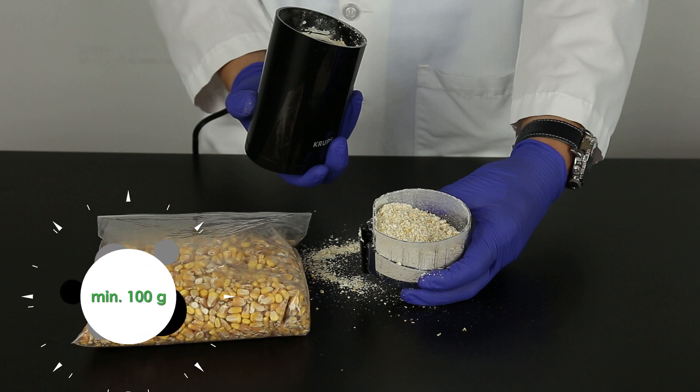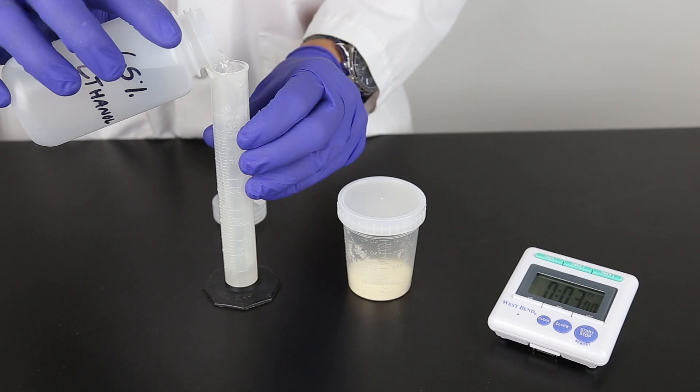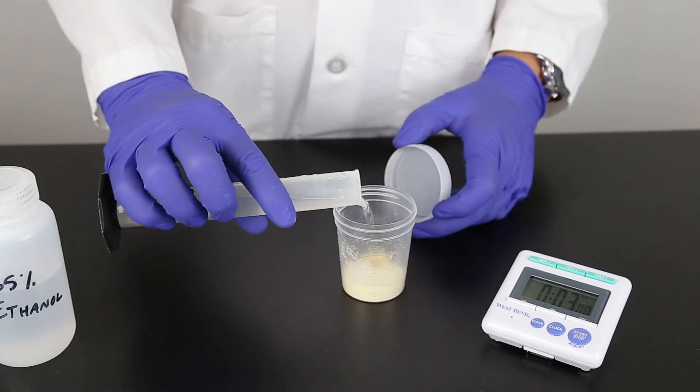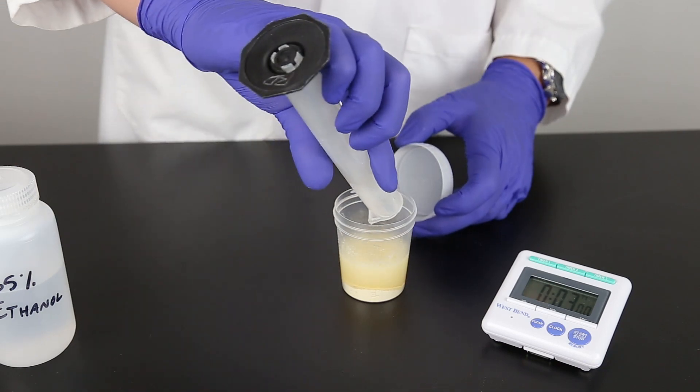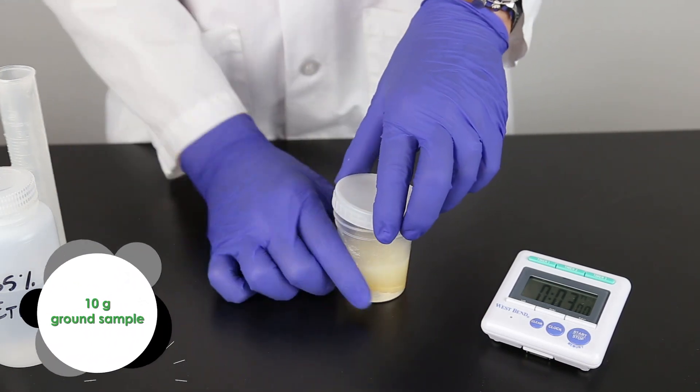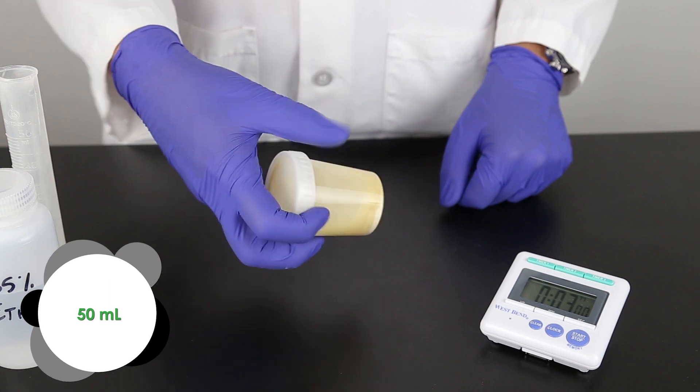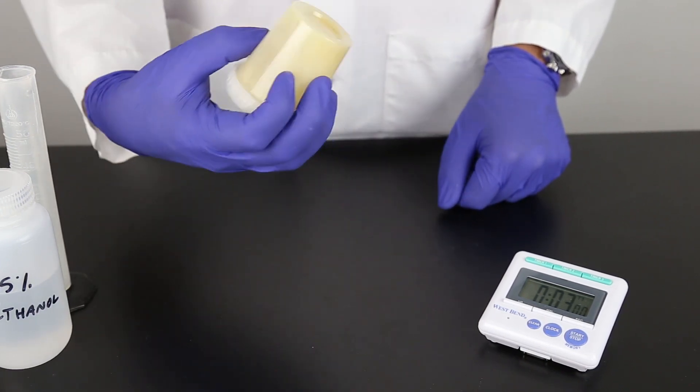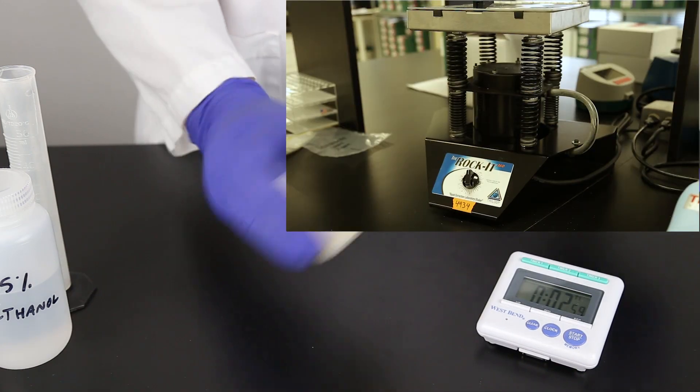It is best to grind a minimum of 100 grams of your sample. The sample is extracted with a ratio of 1 part sample to 5 parts 65 percent ethanol. For this example, we're using 10 grams of ground sample with 50 milliliters of 65 percent ethanol. Vigorously shake for 3 minutes using hand or mechanical means.